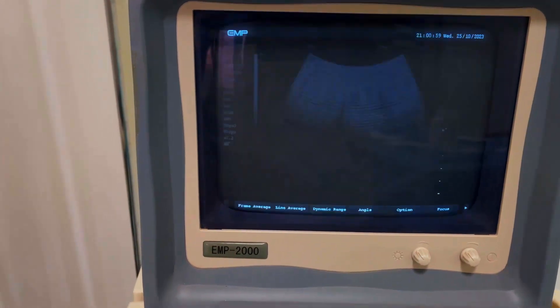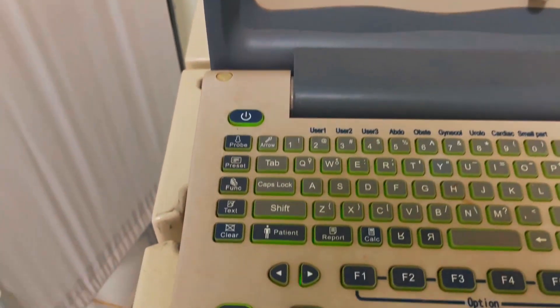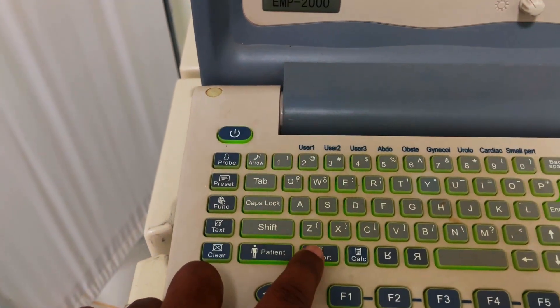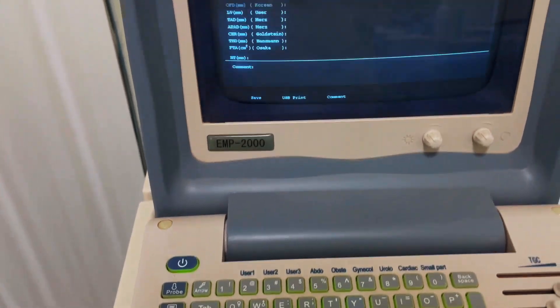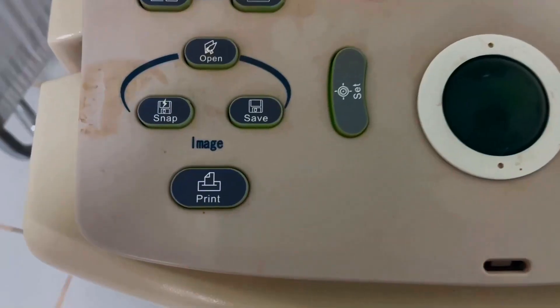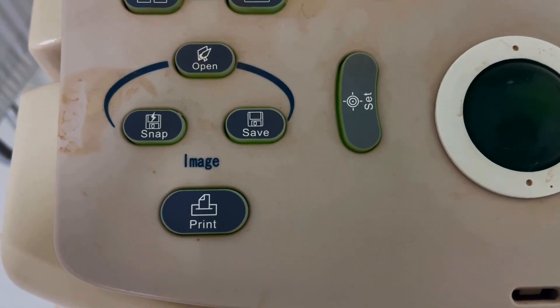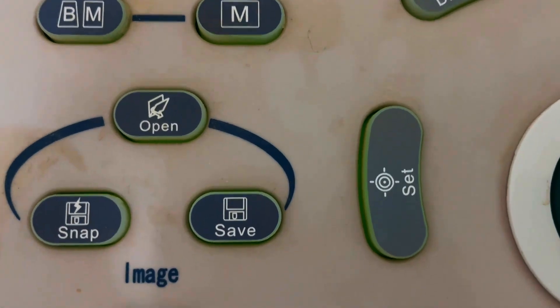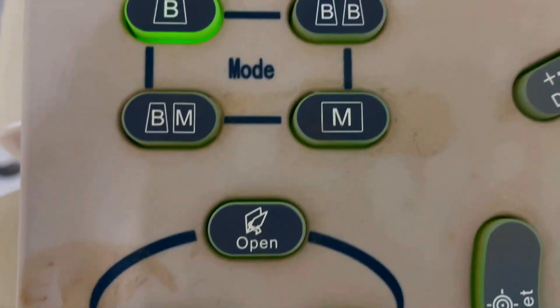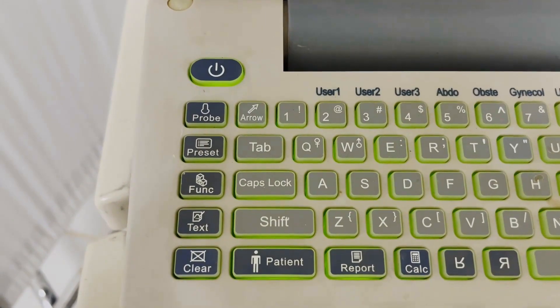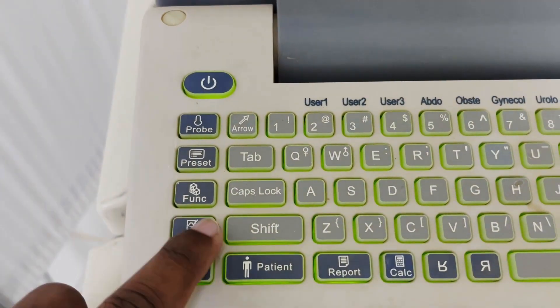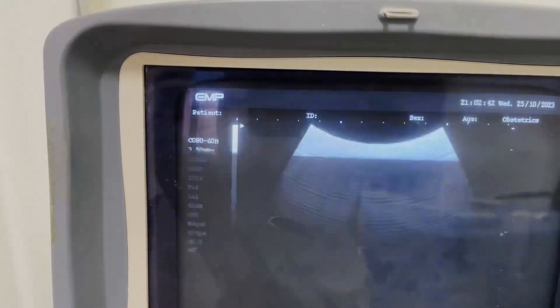This one is your report button — by this you can deliver a report. Here are your save and print buttons — with these two buttons you can save and print the image. This one is the text button — by this you can type any type of comment on your screen.